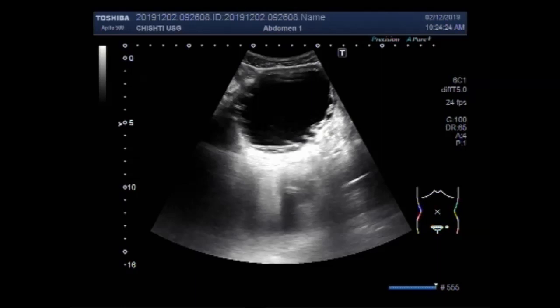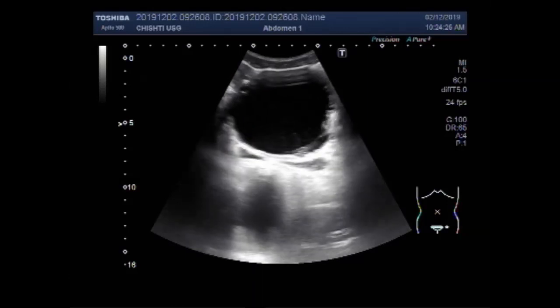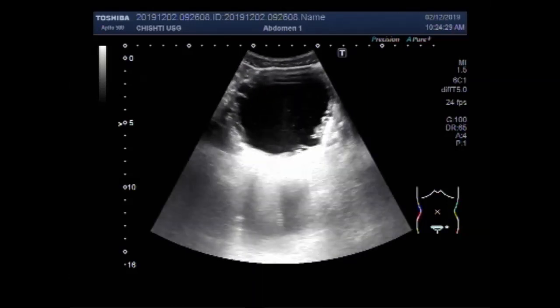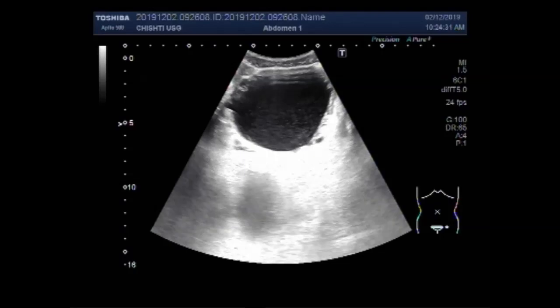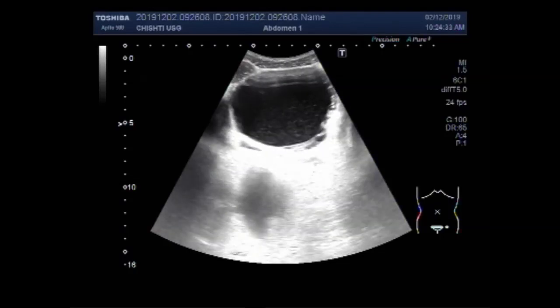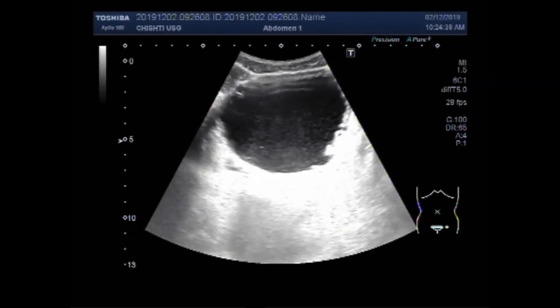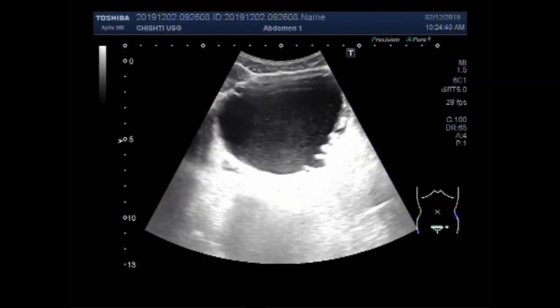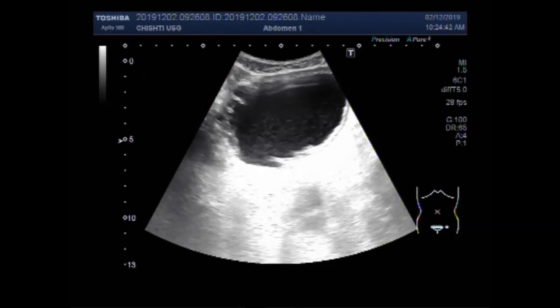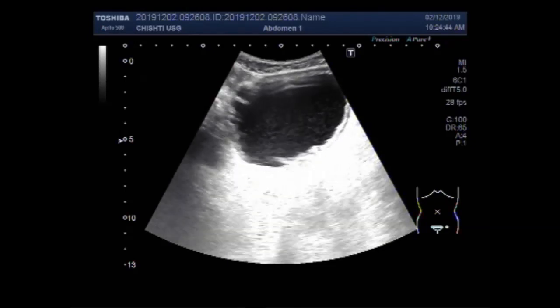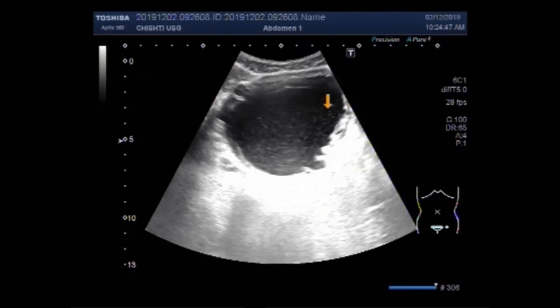You can see the small intraluminal villi-like structures. A large amount of thick sludge is also seen in the urinary bladder. You can see the trabeculi along the urinary bladder walls — along the vesicle walls. This is the thick sludge.